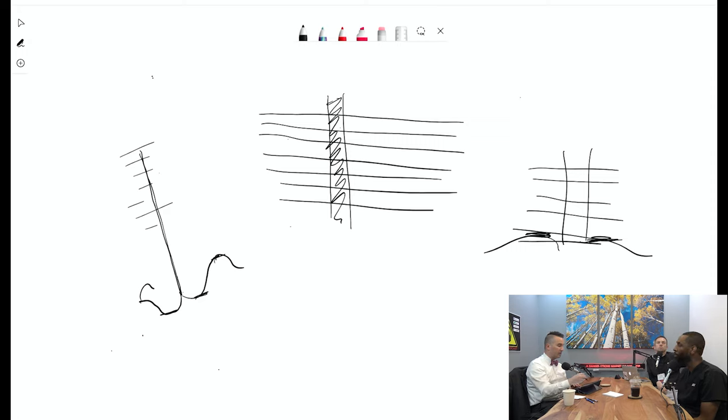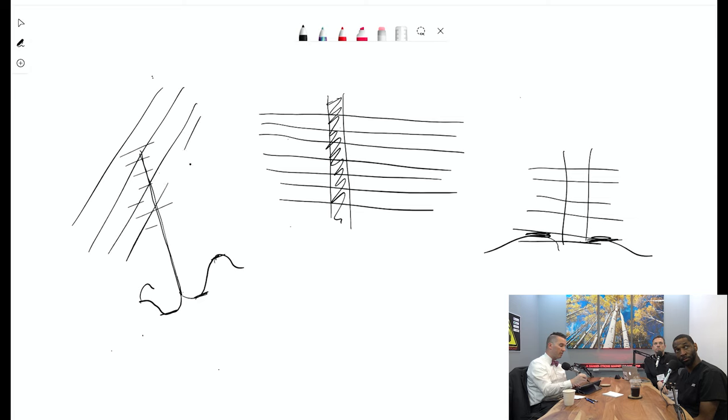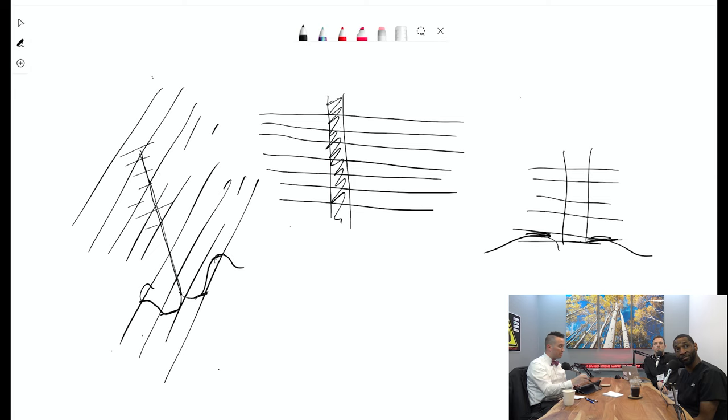A lot of times what people will do, instead of a straight 2D brain, what you really should be doing is triple obliquing it. So you're making it to where no vessel is perfect, but also no vessel sucks. If I'm looking straight down, I would want my slices to maybe be like this. That way I get pretty good superior sagittal sinus, pretty good everything else.